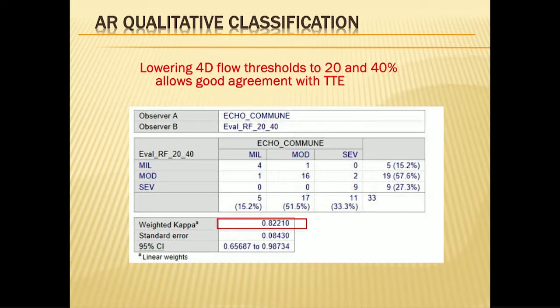But with 4D flow, we change these thresholds to compensate for this systematic difference. And after this change to 20 and 40%, then the miracle happens. We have a very good correlation. Usually in the publications there are very large differences between MRI, all publications with 2D MRI, and echo. So in a way, people say that MR should be the reference standard, at least for ejection fraction.